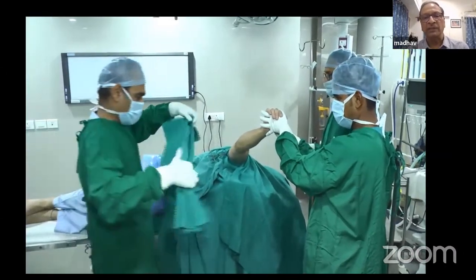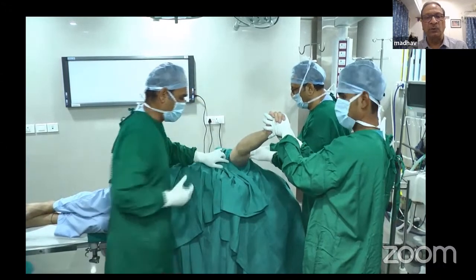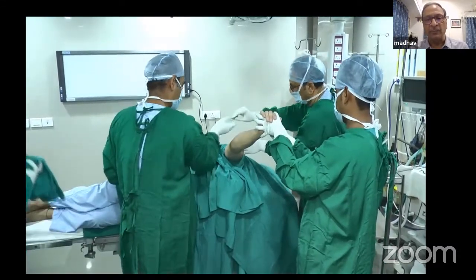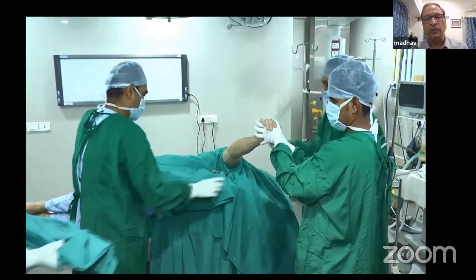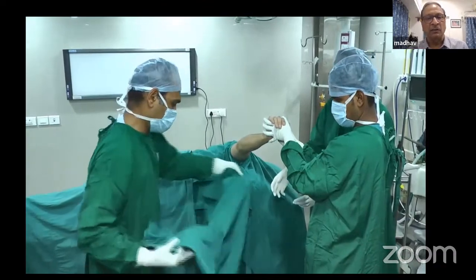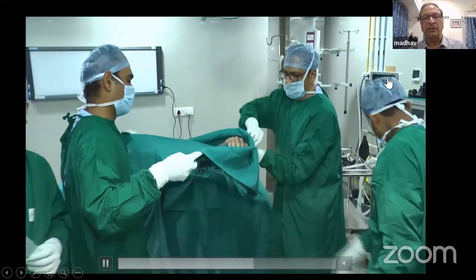One more medium-sized sheet goes over the head end. A second one comes from below. So as you have seen in all the surgeries, everywhere we are using two layers of drape. It is never a single layer of drape. Coming from two different directions, we are using two layers of drape. Now a big sheet goes on the lower part of the table and covers the lower extremities and the lower half of the body.